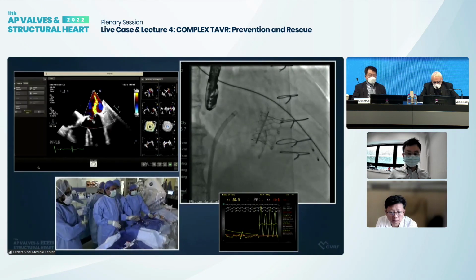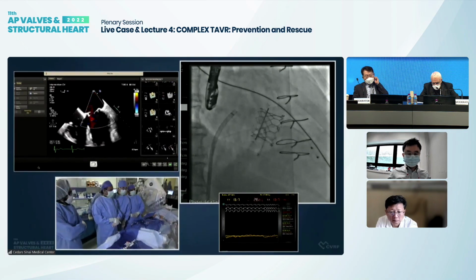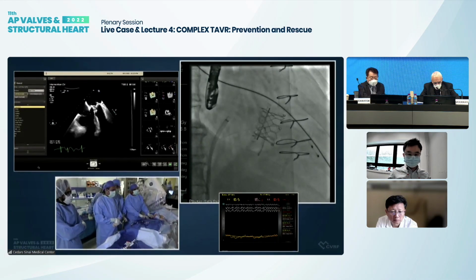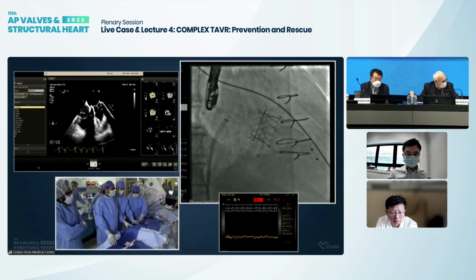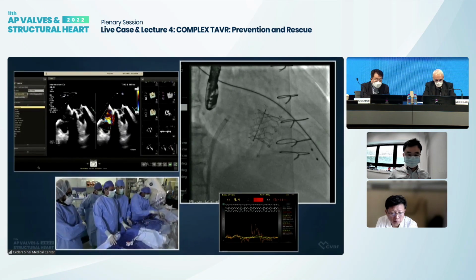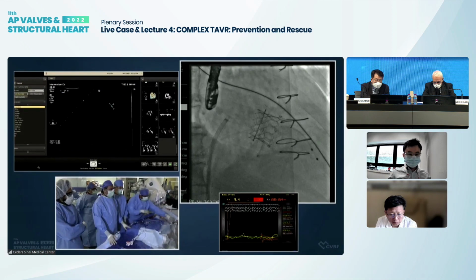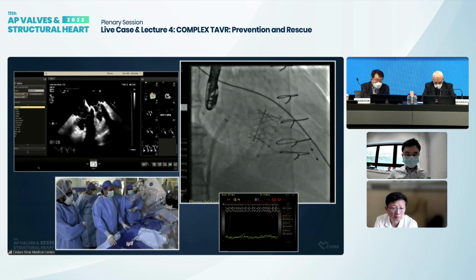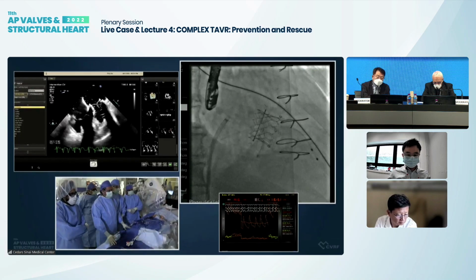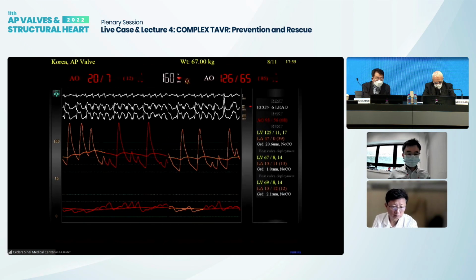So Raj, Jim just pointed out there's a little bit of an EKG change. Can you explain that? What is going on, guys? We had some ST segment elevation, so we had to bring the pressures up. We had some air. You think there was some air that went through catheter exchanges? Yeah. All right, let's just support the pressure. Occasionally, that's one of the things of working in the left atrium, when you're measuring hemodynamics and you're flushing things, this will happen. So we have to be very, very careful. All right, so the pressure is not bad. It's about 100. So we'll let it settle down.